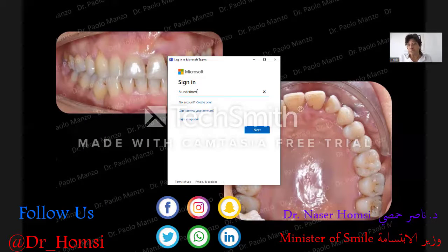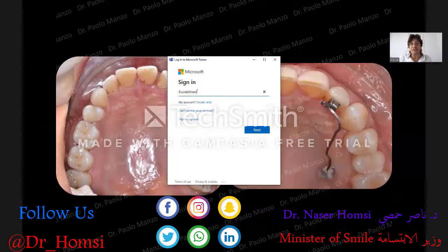And when I proposed the appliance, she was so scared. But when I proposed something like a minuscule, a piece of wire and a bracket, she was very happy about this. And I corrected this with the rotation. Now I'm working with the self-ligation because it's like a tube, so you can work with two hands. You don't need assistant work. You don't need to have some people around. It's very easy to manage. It's very fast to manage.